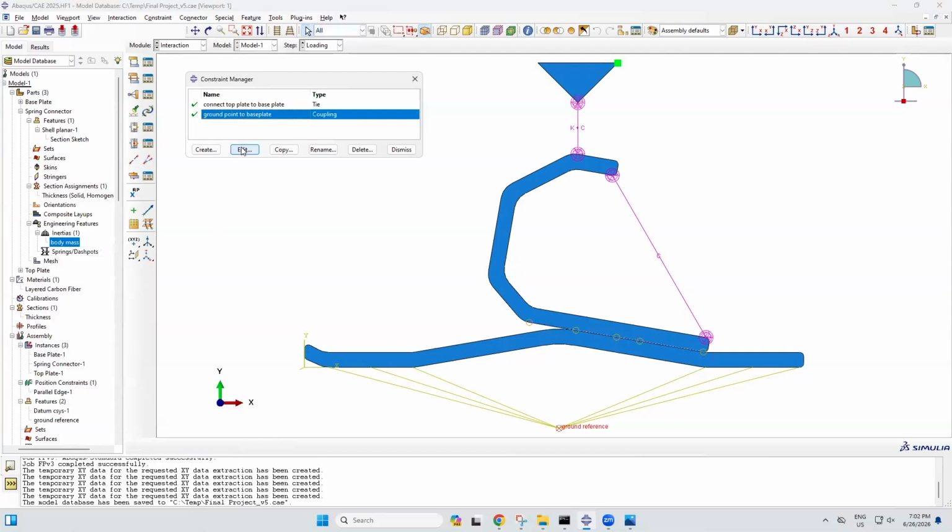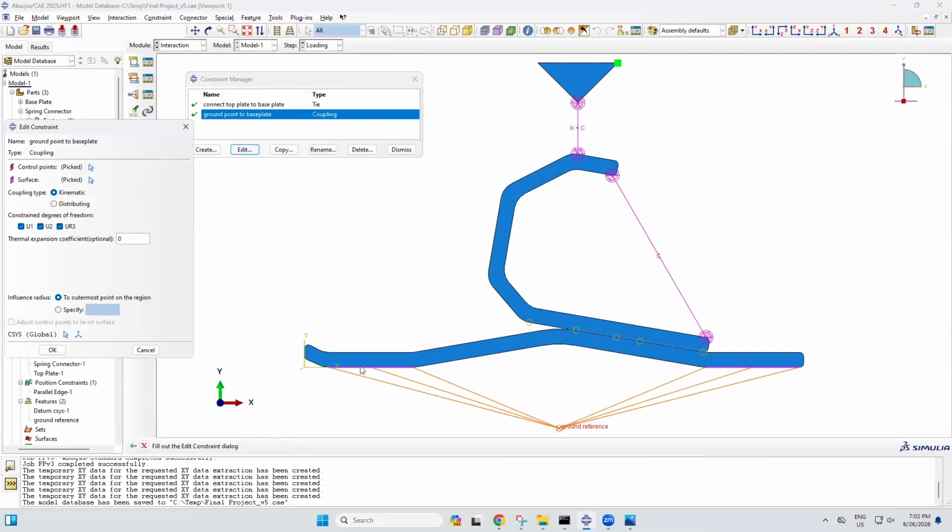Next, I created a coupling constraint from the ground reference to the flat edges of the base plate. This is used to constrict horizontal, vertical, and rotational degrees of freedom. Because these are shell elements, you don't need to constrict rotation, but the point is selected, so UR3 has to be selected as well because the point can technically rotate. Using the coupling allows for the reaction forces and displacement to be referenced with the ground reference and unified for visualization purposes.